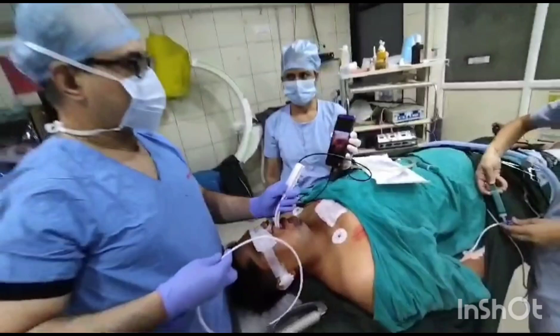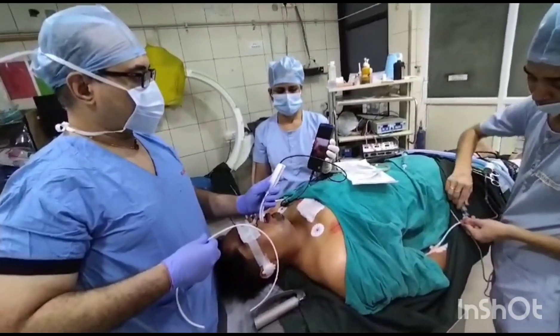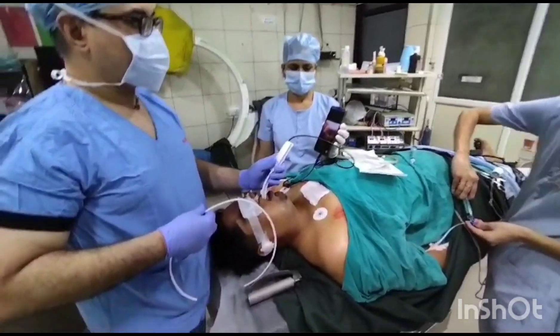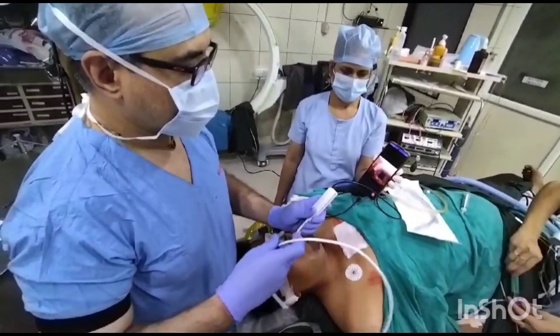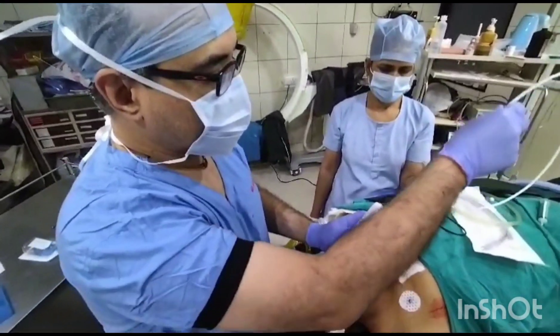Please give suxamethonium. We have a beautiful view of the larynx. I have asked to give suxamethonium so we can relax the patient and intubate. The suxamethonium is given. I will give a few seconds for it to act.